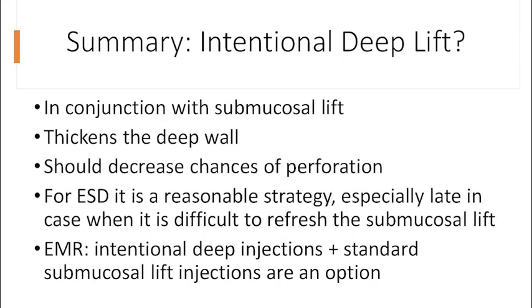Intentional deep wall injection and expansion in conjunction with the submucosal lift should decrease the risk of perforation during ESD or piecemeal EMR. This makes sense especially later in the case. The authors are now using this approach clinically.